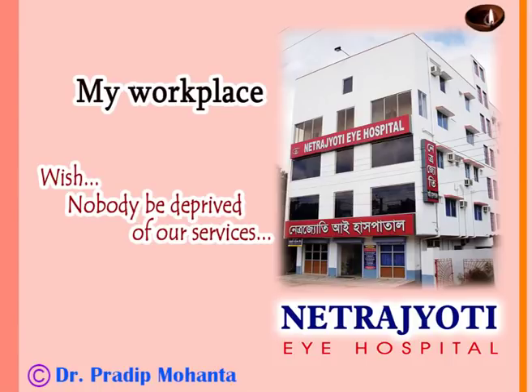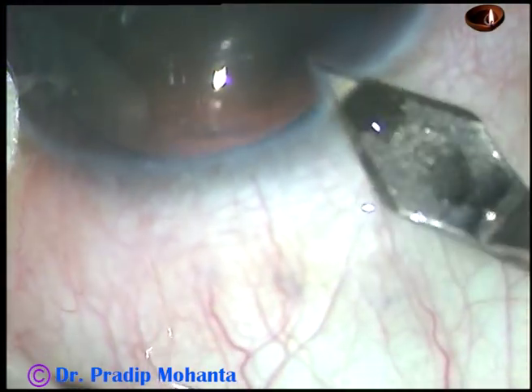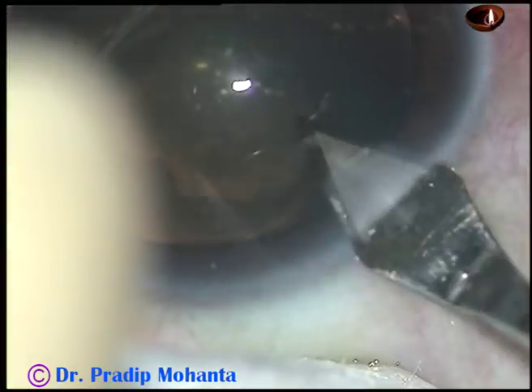Friends, welcome to my hospital at Ranaghat, West Bengal, India. This is a posterior subcapsular cataract. Let us observe the management of this case.